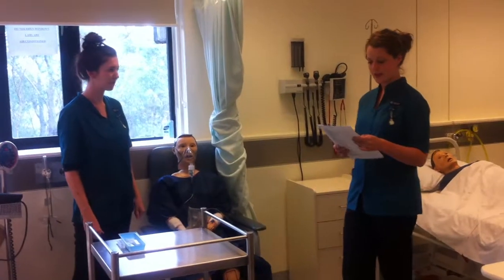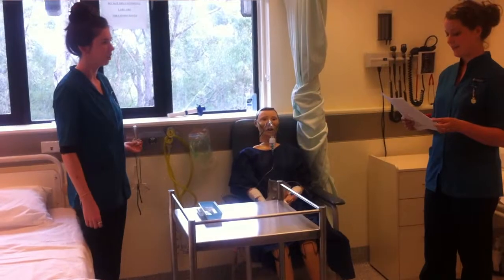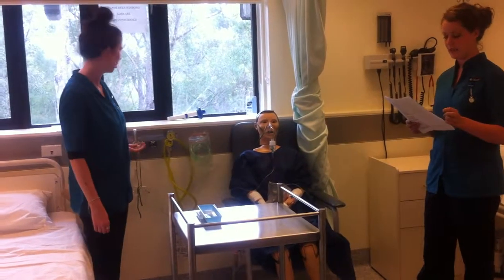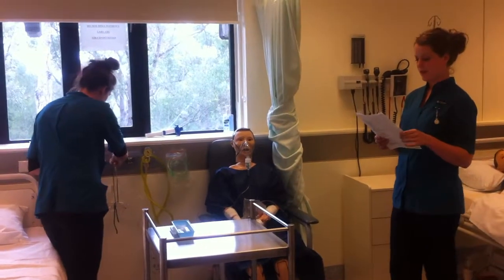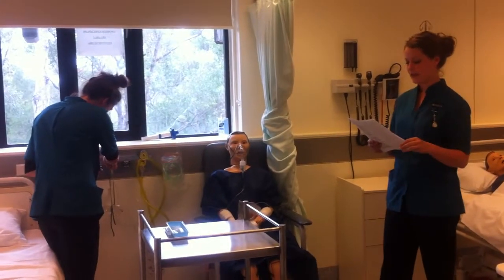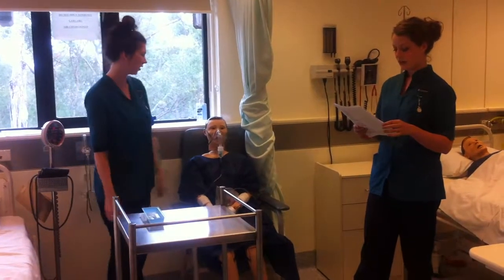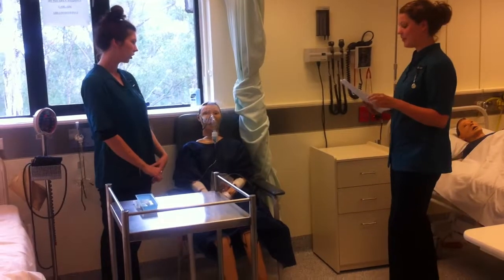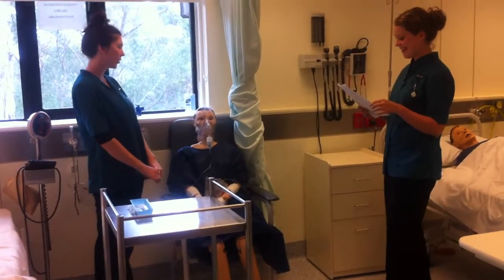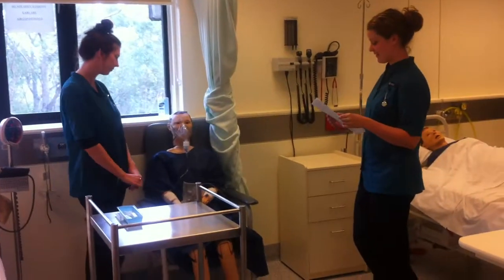Alright, so we're going to switch on the gas supply. In this case, we're going to use air at a flow rate of 6 to 8 litres per minute. This is to ensure adequate aerolysing of the drug. Penny will encourage the patient to breathe normally and take a few deep breaths every couple of minutes. And please don't speak.